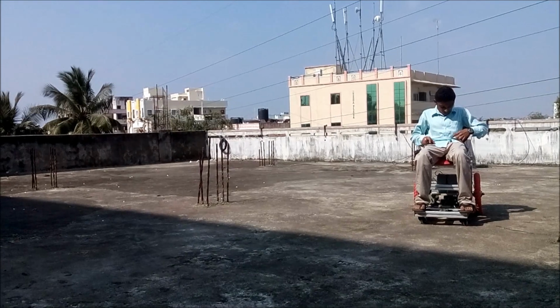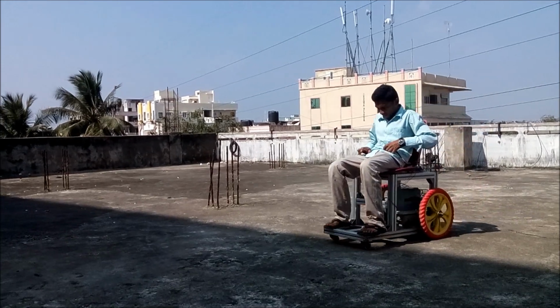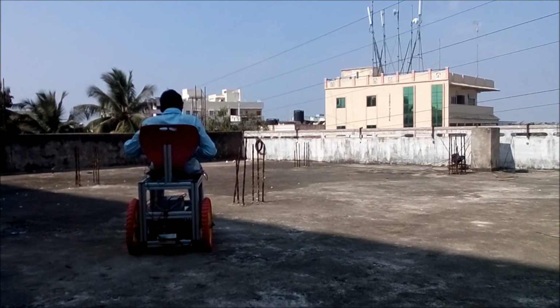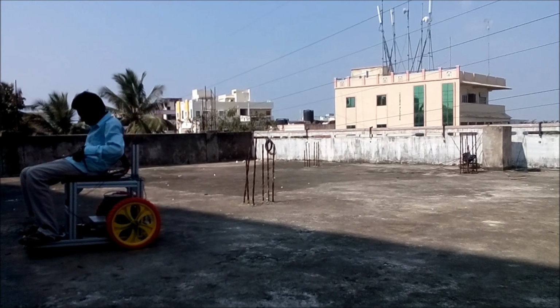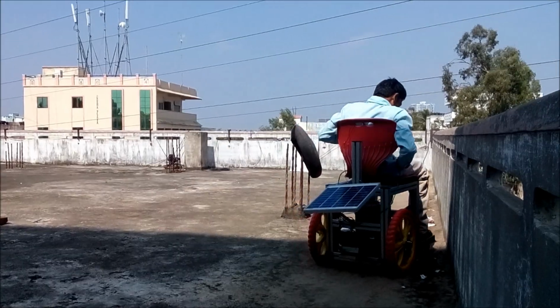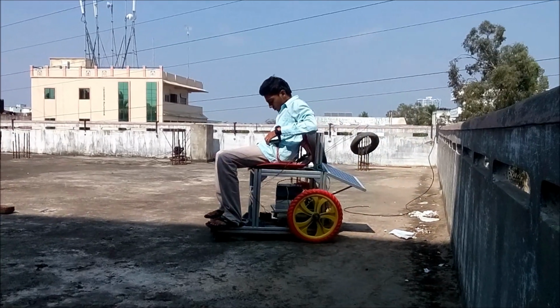Hello, this is Bharati. Let us watch the video of our project. We are working on a solar panel to implement in our wheelchair in order to charge the battery and to use it more efficiently.